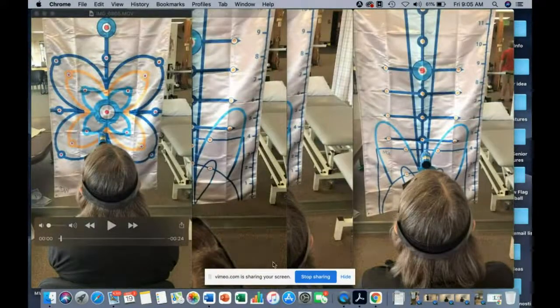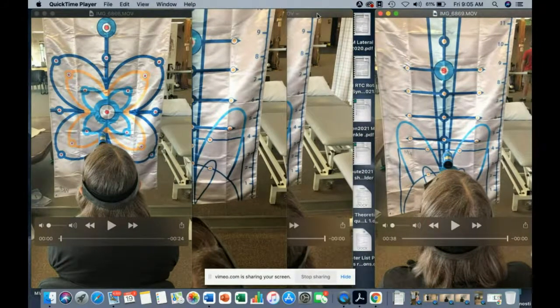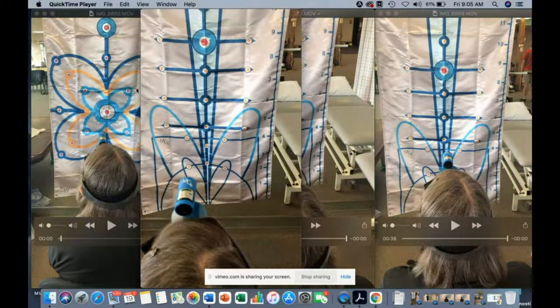All right. So let's start with some ocular motor things. So this is a series of videos. I'll spread these out just a little bit on my desktop here, so we'll be able to get to all of them. I'll bring them to the front. But these are in my particular clinic. These were taken with permission, but I had a woman coming in. She had an insidious onset of waking up one day with some dizziness.